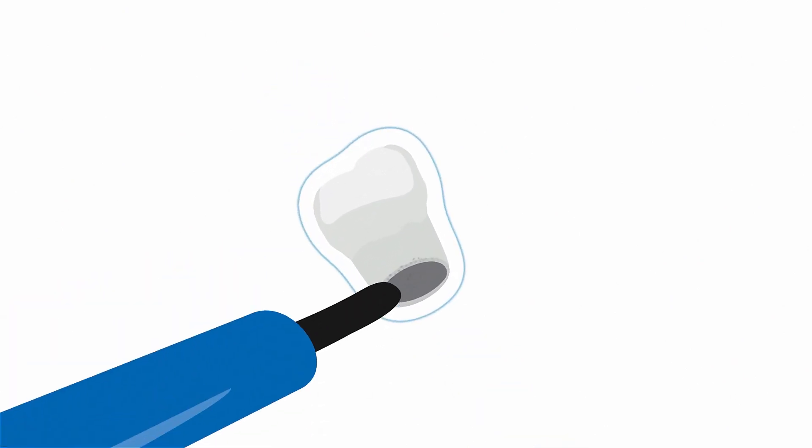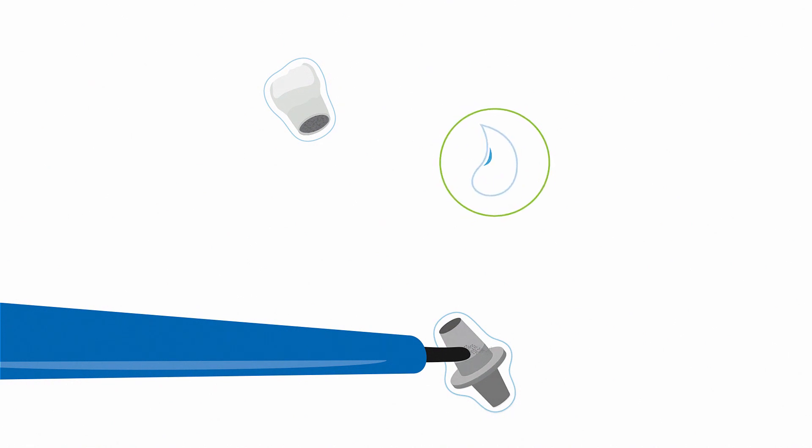To get the most durable implant abutment cementation, you definitely need to roughen the surface first. Therefore, you sandblast with low pressure, then rinse and dry both surfaces.